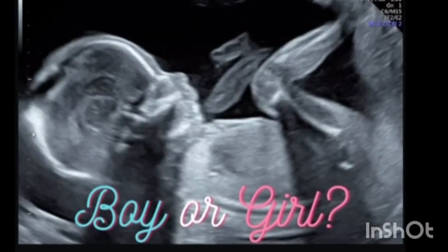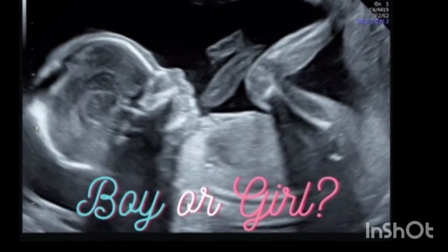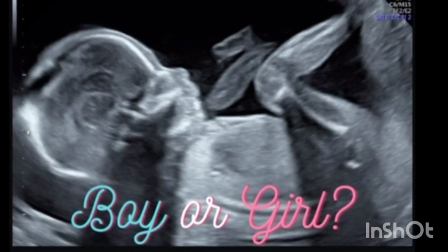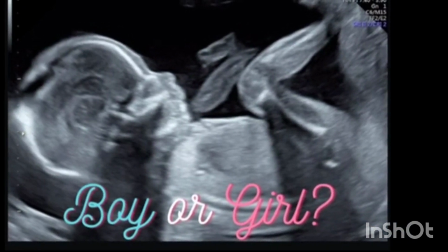How to tell a baby's gender from an ultrasound. During pregnancy, many doctors are able to help parents with an ultrasound to determine the baby's biological gender, which is very exciting. Once you find out whether the baby will be a boy or a girl, you can throw a gender reveal party. It also gives you and your partner plenty of time to think of a name.